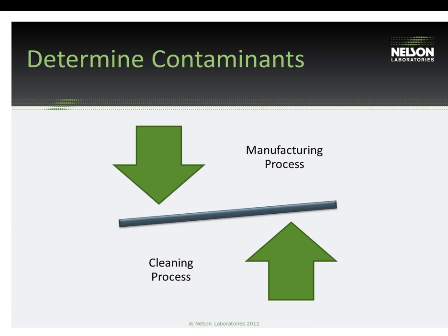And breaking these down into these groups is what is going to help us choose the test methods that are most appropriate to quantify those residues. And so getting this list is very important. Sometimes this can be a very lengthy list. Sometimes devices come in contact with many, many different potential contaminants.